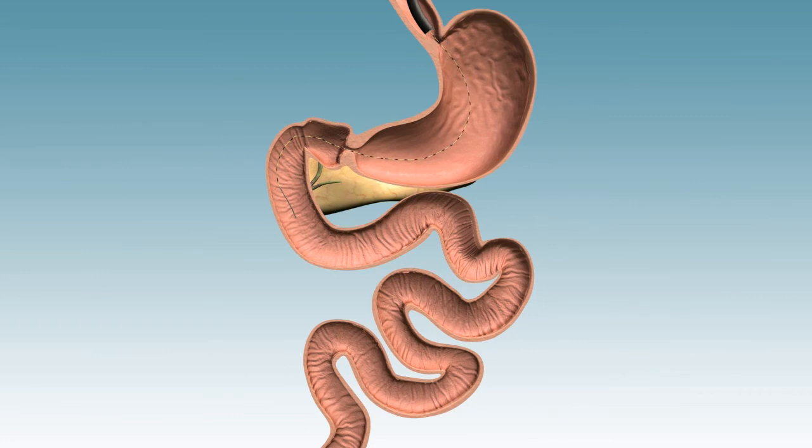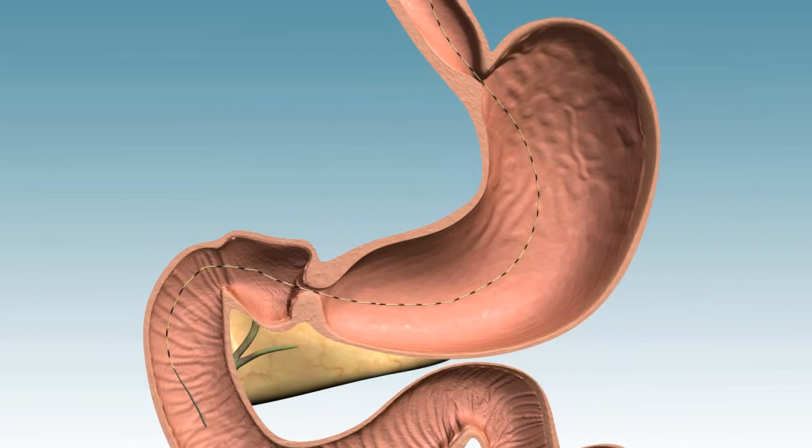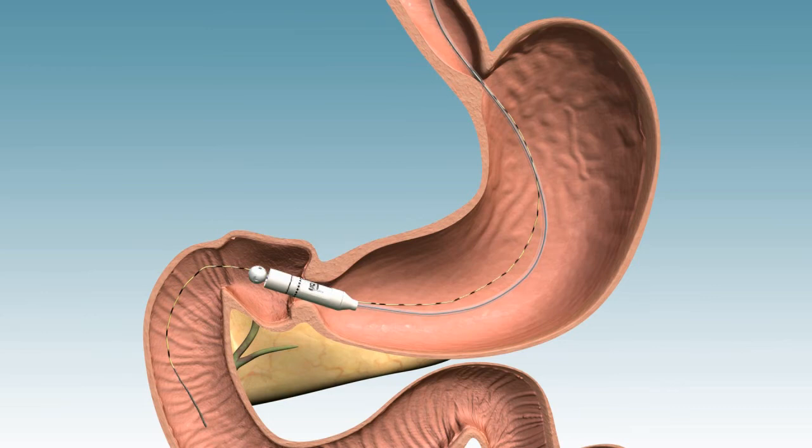The delivery capsule is then threaded over the guide wire into position within the duodenal bulb, traversing the pylorus. The guide wire is removed and the gastroscope is reinserted to confirm appropriate position of the delivery capsule.